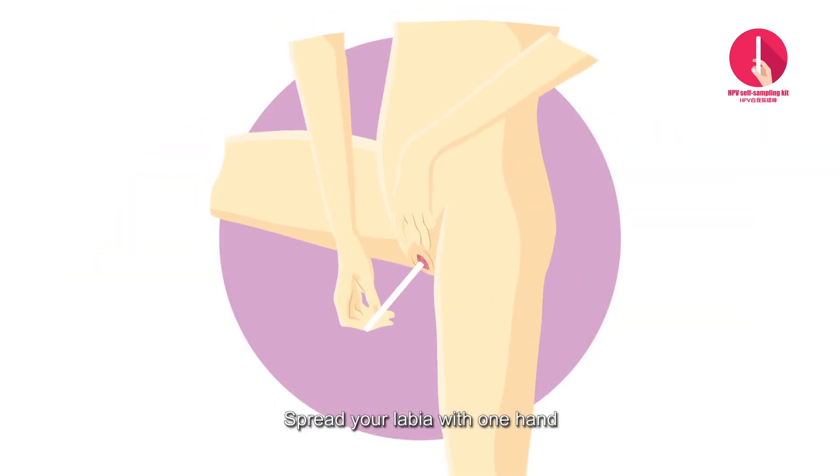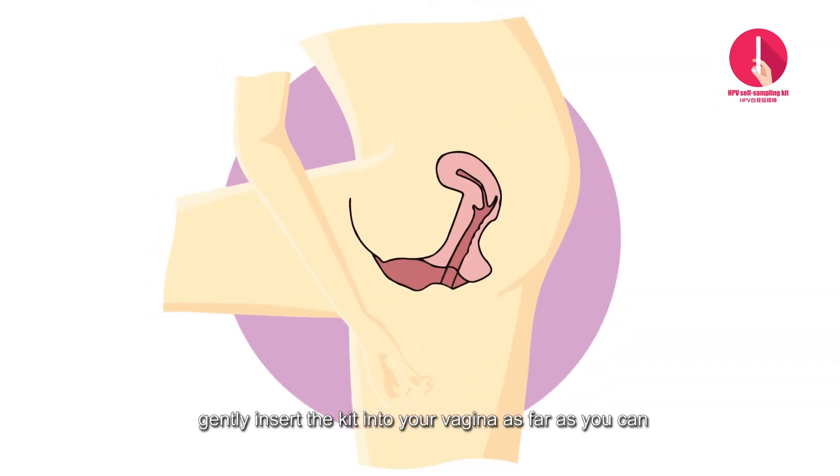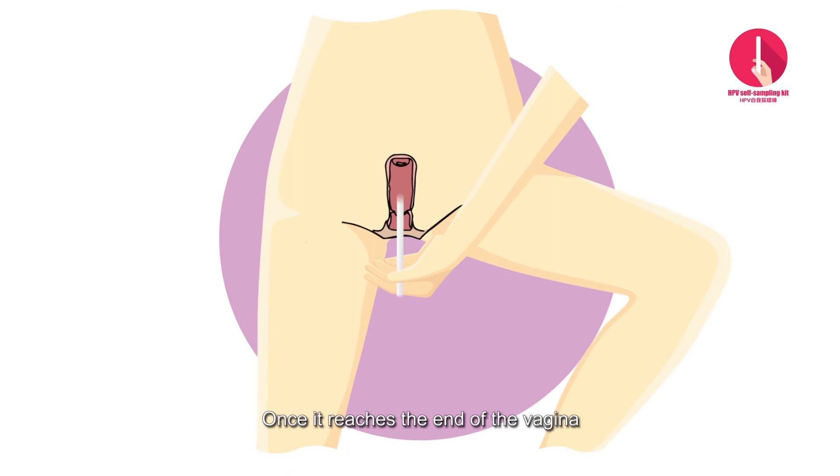Spread your labia with one hand and with the other, gently insert the kit into your vagina as far as you can, until you feel firm resistance or until you reach the top end of the vagina. Once it reaches the end of the vagina, rotate the kit three to five times to gather cells.